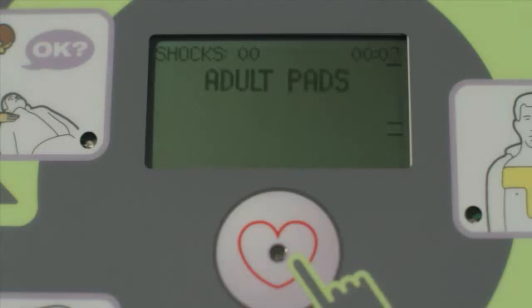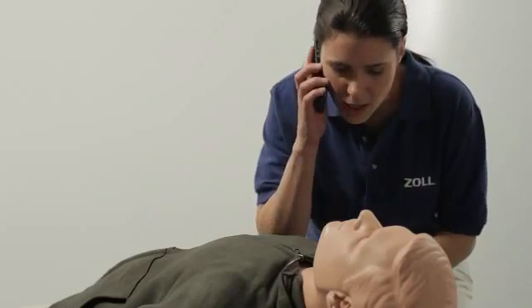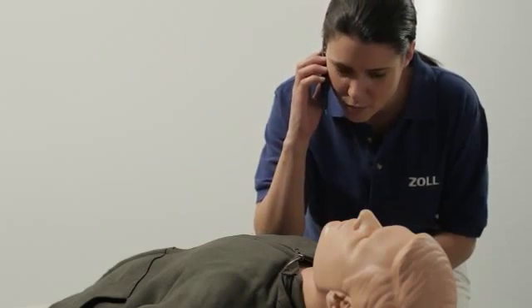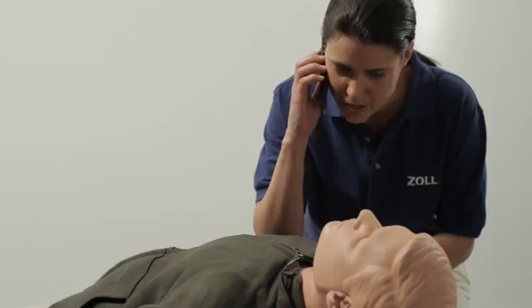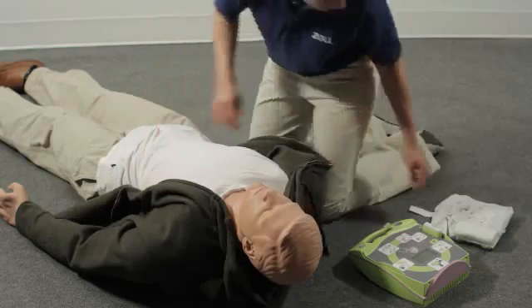Adult pad. Stay calm. Check responsiveness. Are you okay? Call for help. Hi, this is Julie Sanders. I'm at 445 North Park Avenue and my friend is unresponsive. Please send help. Attach defib pads to patient's bare chest.